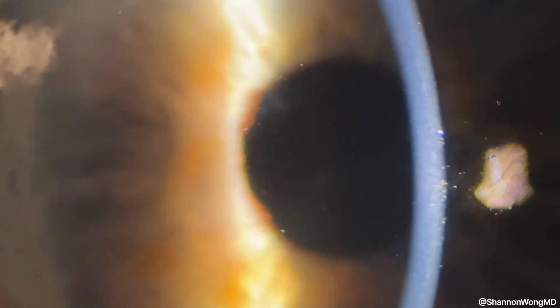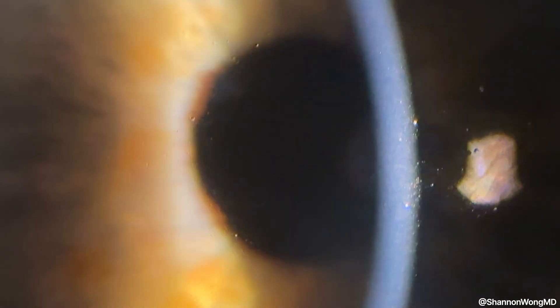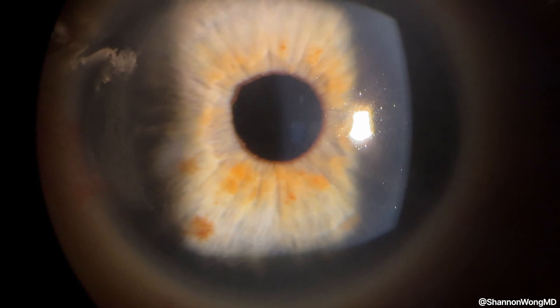Through the slit lamp on post-op day one, the cornea looked pristine, and the patient's uncorrected vision was 20/25.